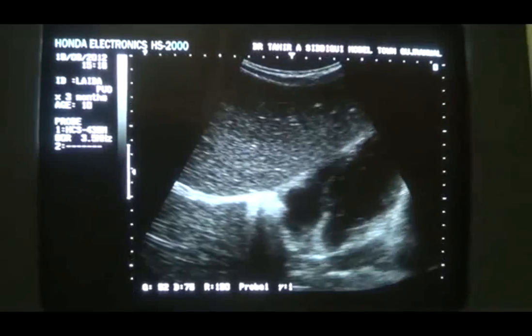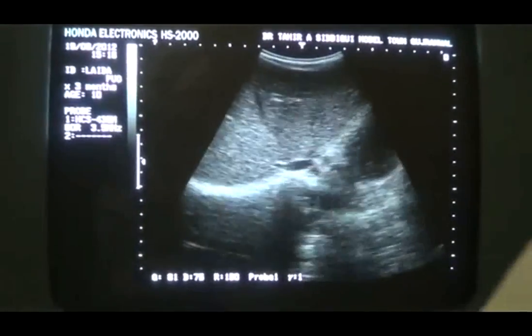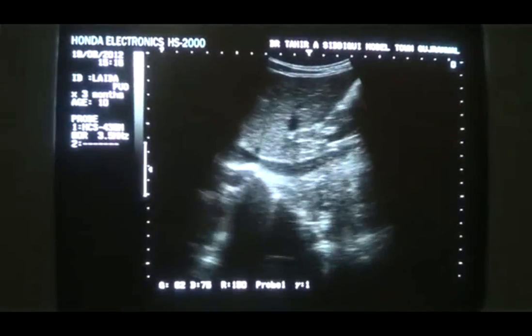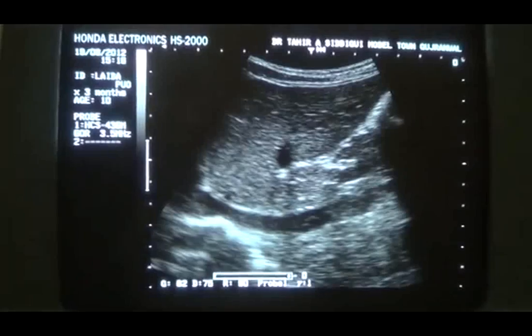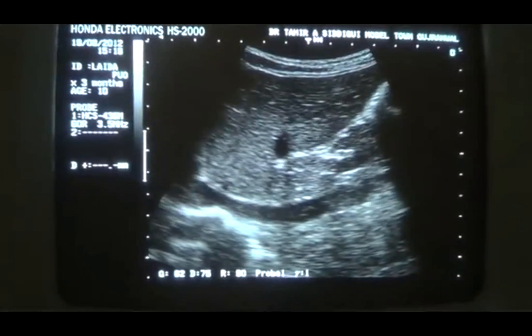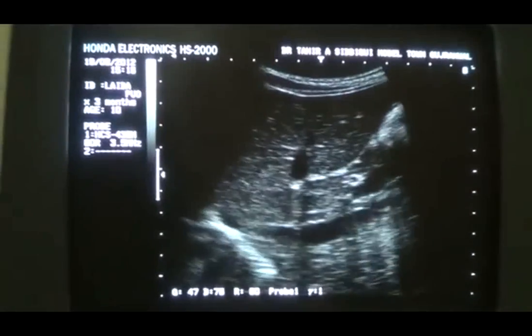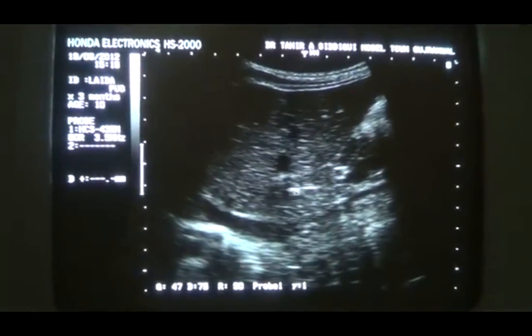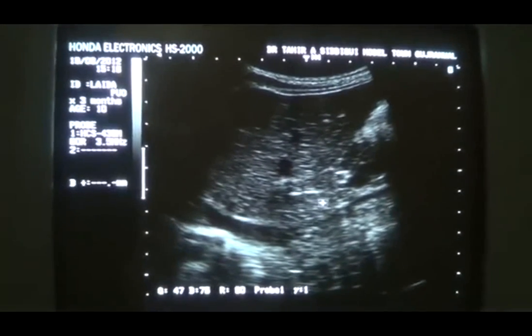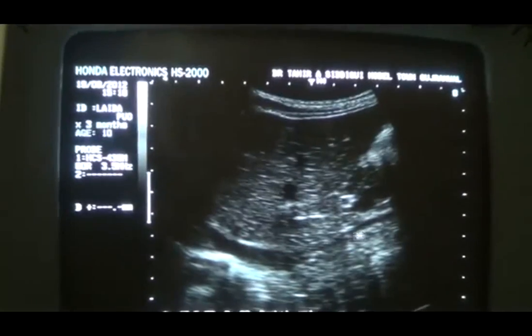This is the subcostal view of the heart, which is not dilated. Here we come to the IVC. Now the IVC is clear and of normal caliber. This is the caudate lobe of the liver, because it is bounded anteriorly by the ligamentum venosum and posteriorly by the IVC.